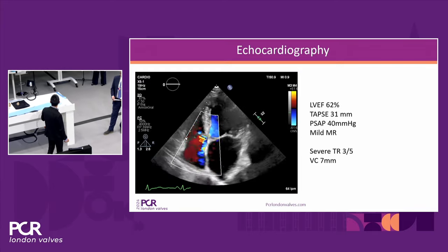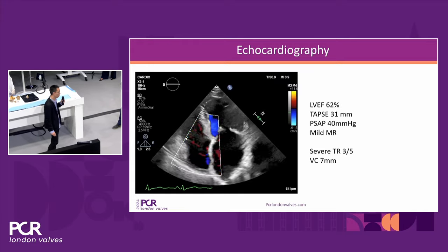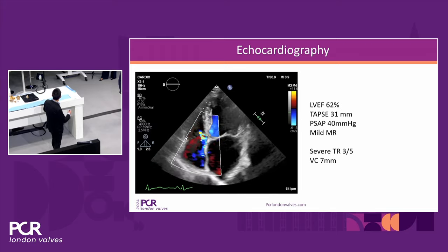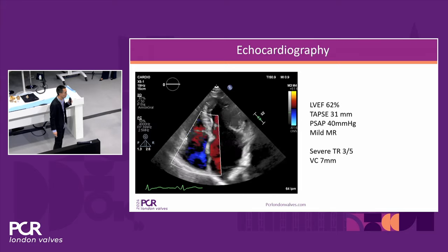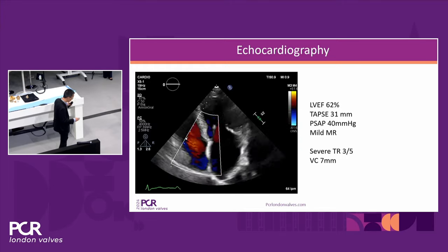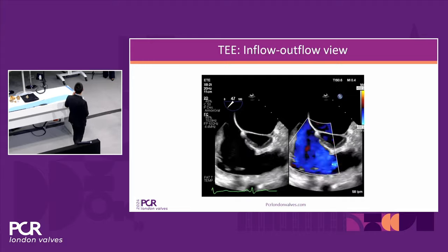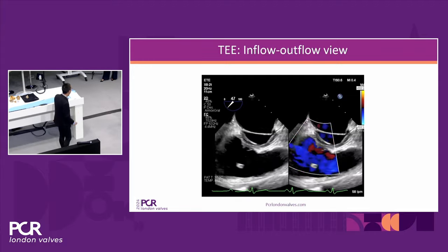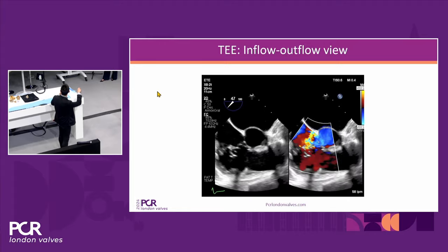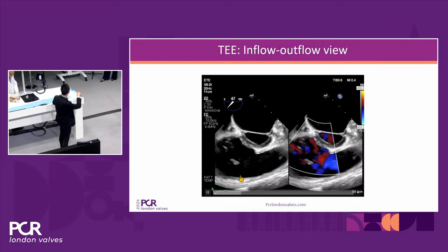Okay, so in this transthoracic echo, we can see a good LV ejection fraction, a good RV function. We can identify an eccentric severe TR with a vena contracta of 7 millimeters. And moving to the transesophageal imaging, we start with this inflow-outflow view. In this view, we can identify here in the center the papillary muscle, the anterior papillary muscle.